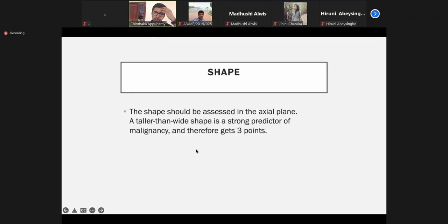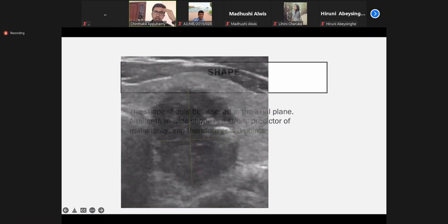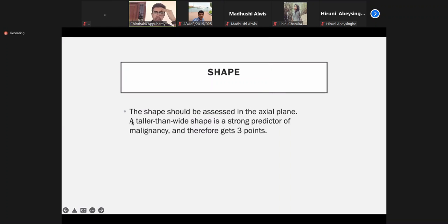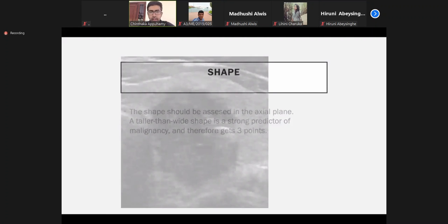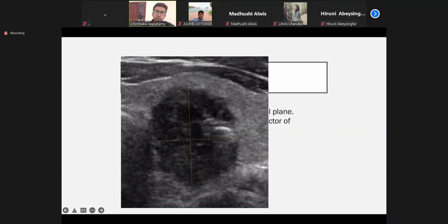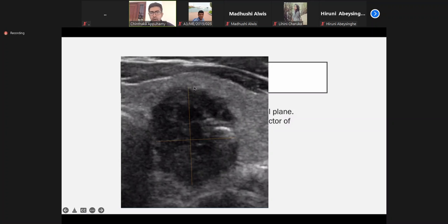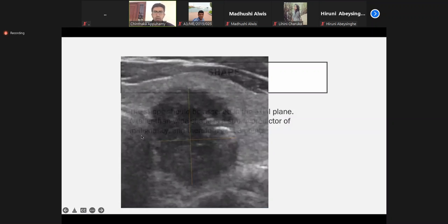Then comes the shape. Shape is a very strong predictor. The shape should be assessed in the axial plane. A taller-than-wide shape is a strong predictor of malignancy and therefore gets three points. In this nodule, the vertical height or AP diameter is larger than the transverse diameter — that is a suspicious observation. Apart from that, it is hypoechoic, has specs of calcification, and the margins are irregular and ill-defined.